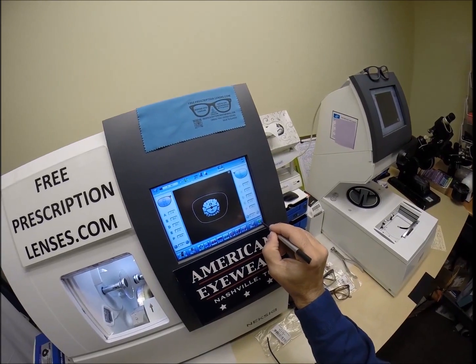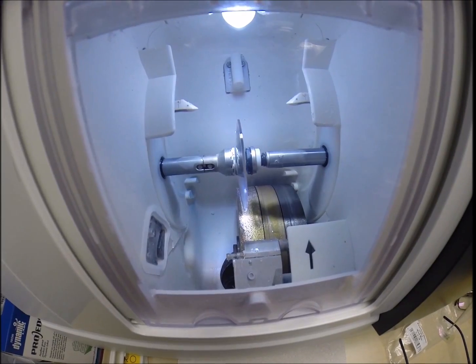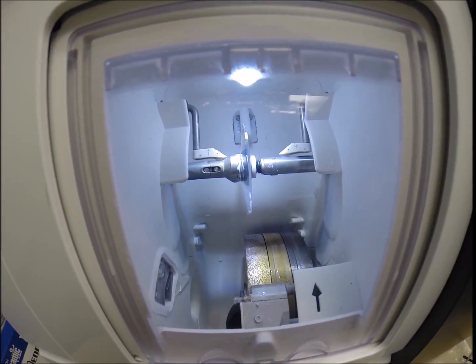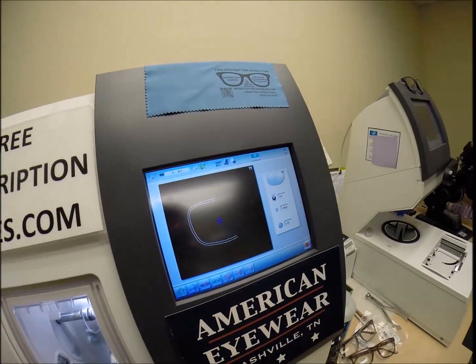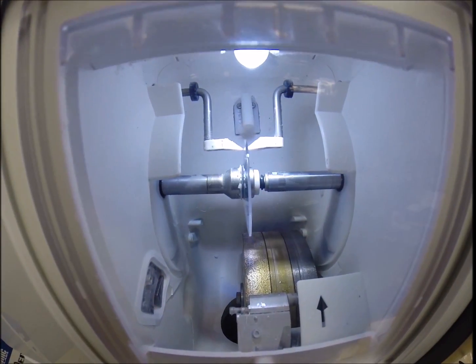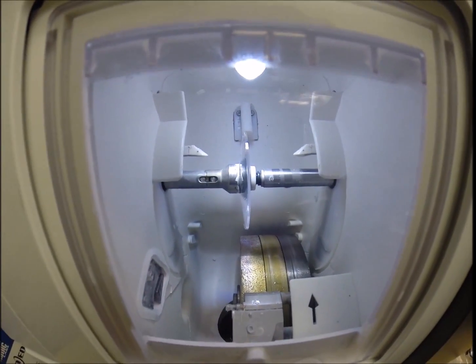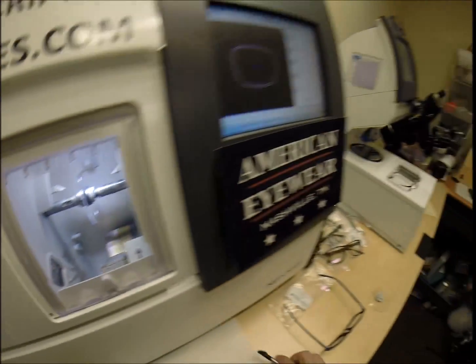So I'm going to hit the green arrow. The door closes, the clamp shuts. The lens is going to be traced by 2 white styluses, making sure that the lens is large enough to fit into the frame. And you can see it's just going around tracing the shape. And then the old carpenter saying, measure twice, cut once. It's measuring the thickness of the lens at every point to know exactly and precisely where to place the bevel, so you have the least amount of edge thickness showing, of which you will have none in this frame.